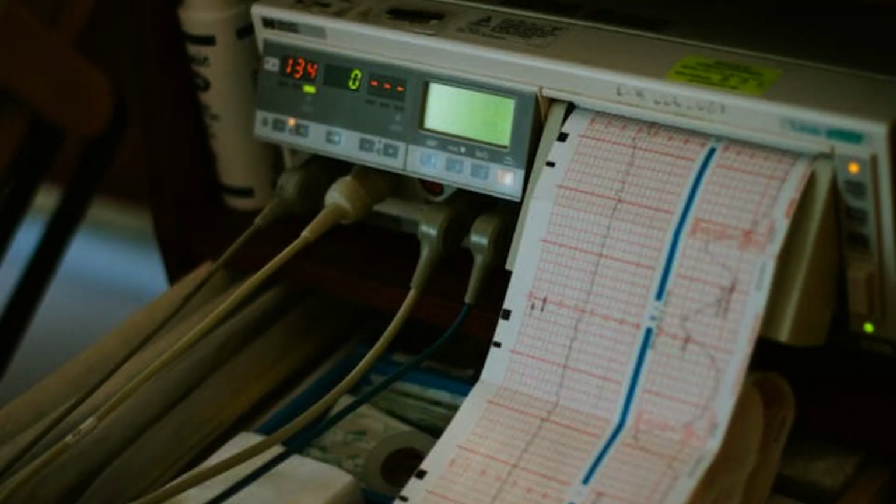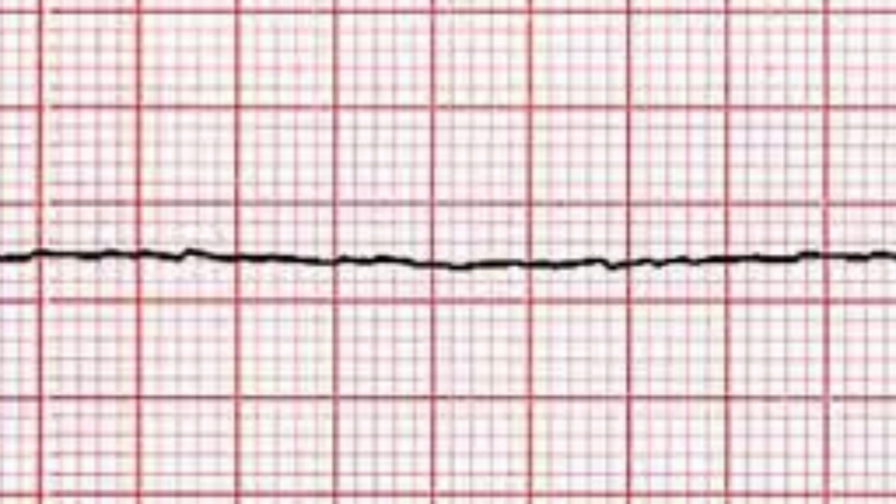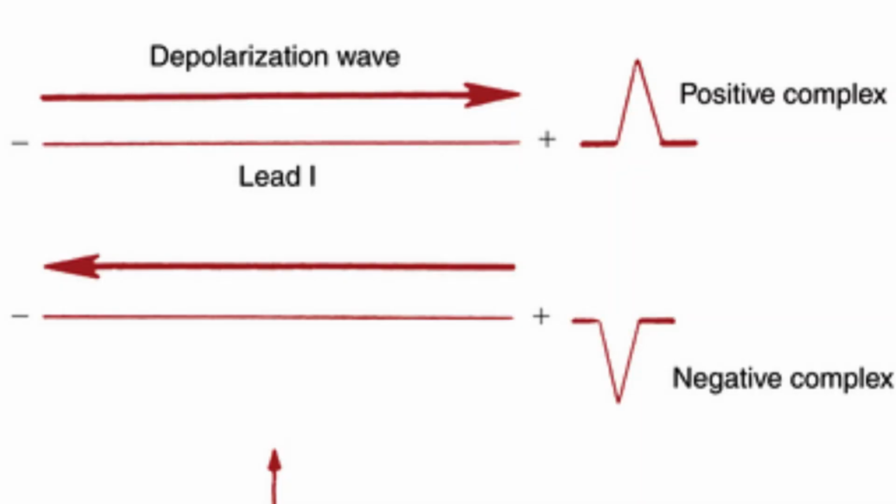Next, I would like to talk about the flat line or isoelectric line. Now, this isoelectric line is recorded when there is no electrical activity. Obviously, when there is a stopping of the heart, or you can even record it when there is nothing attached to the ECG machine. This means it records voltage as 0, totally 0. Now, any voltage that goes above this flat line, isoelectric line, or below this line is called a wave. That is the definition of a wave. Now, if it goes above the line, it is called a positive wave. If it goes below this line, it is called a negative wave.